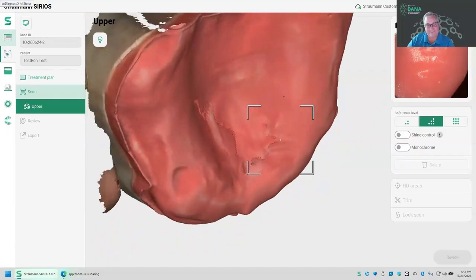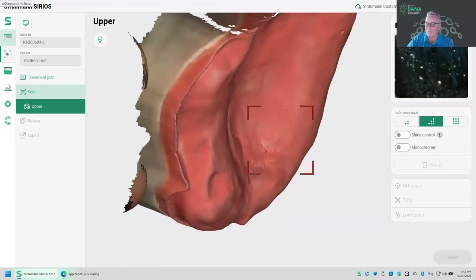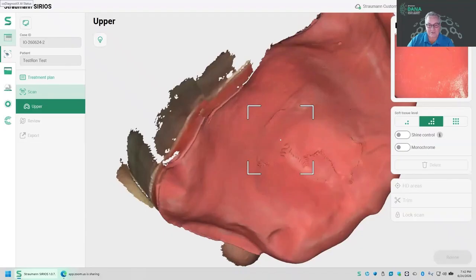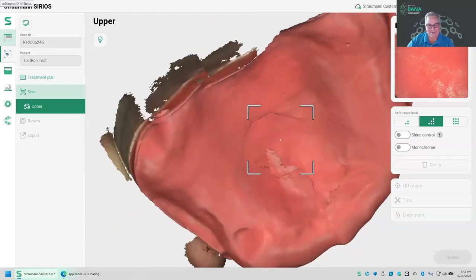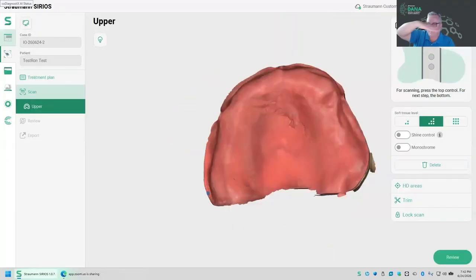But my scanner trainer friend said, why do you bother doing that? Just delete it and start over, because scanners are so fast today that it's less time to start over than it is to fix the surfaces. So that's your choice. Understand that as scanners get faster and faster, of course, now I'm continuing to scan over and over, and I should stop while I'm ahead. So the technique essentially for an edentulous arch, you're going to build the arch on the occlusal, capture the facial while it's easy. And then the palate is back and forth and back and forth and back and forth like that.